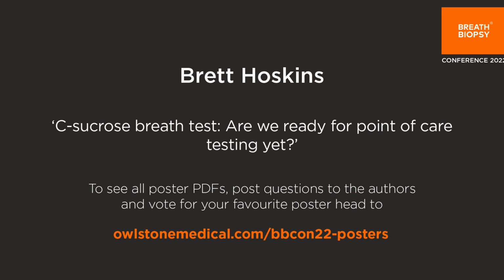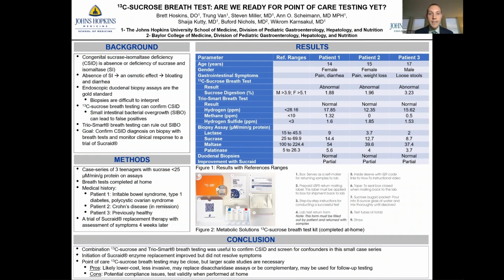My name is Brett Hoskins, and I'm a third-year clinical fellow in the Division of Pediatric Gastroenterology, Hepatology, and Nutrition at Johns Hopkins Hospital. This is a case series study with the goal of confirming congenital sucrase isomaltase deficiency using combination breath testing at home. Congenital sucrase isomaltase deficiency, or CSID, is absence or deficiency of sucrase and isomaltase. This causes an osmotic effect in the intestines, leading to bloating and diarrhea.